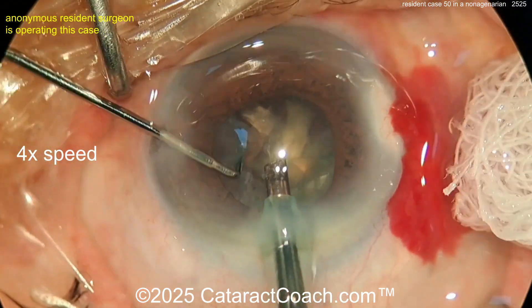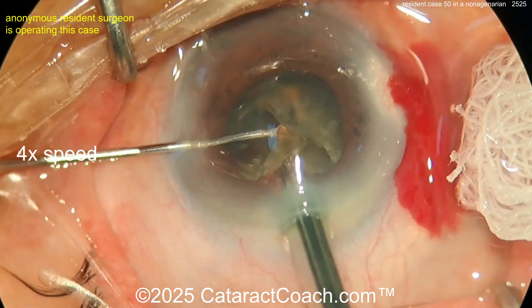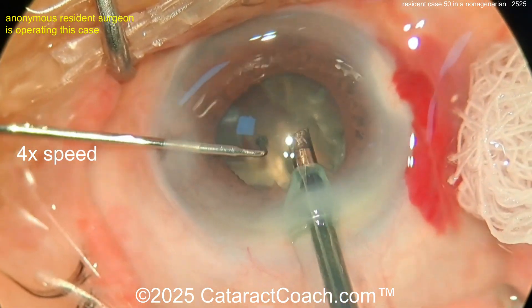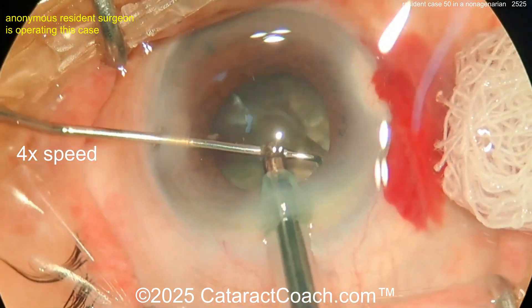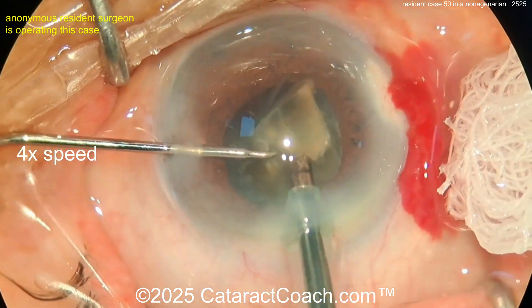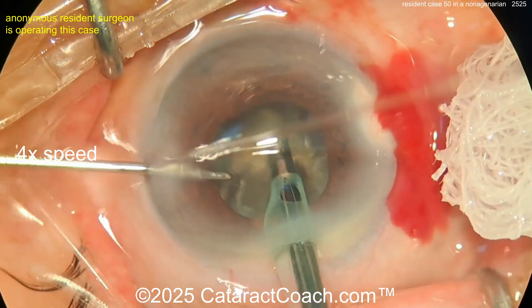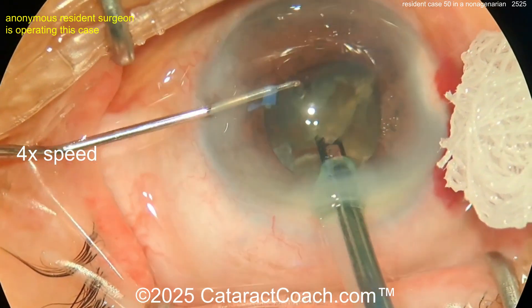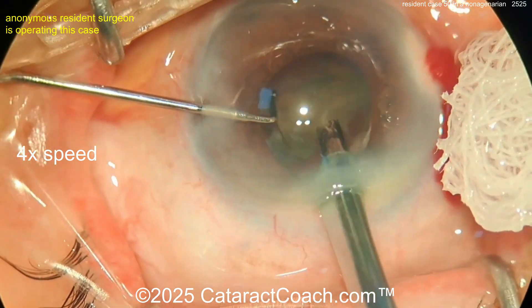Taking these pieces down — I like having them to the iris plane. There's a little bit of bounce of the iris and anterior chamber, and good maneuvering rotating around. This is a smaller pupil case for case 50 — you chose a challenge. I'm glad you're testing and pushing your skills by doing these tougher cases: nonagenarian, smaller pupil, tougher visualization. These are all valid challenges, and you're doing a really good job.